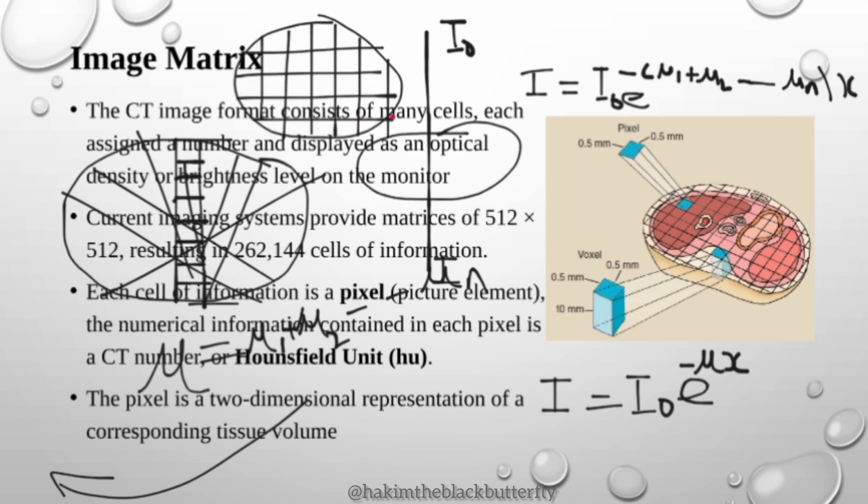They can be thousands of pixels, hundreds of thousands of pixels. So it has to do all the mathematics to calculate the attenuation coefficient for every individual pixel, because every pixel must have a different value, because every pixel is representing something different.